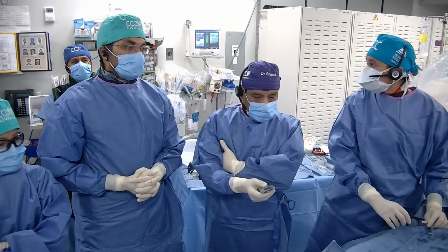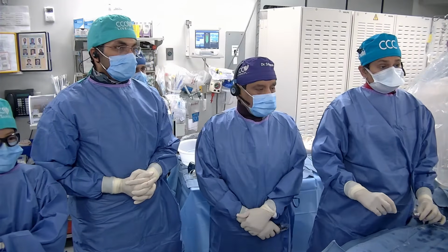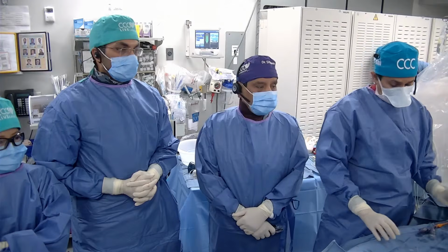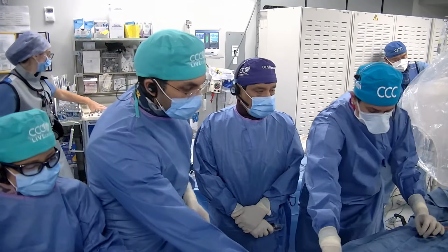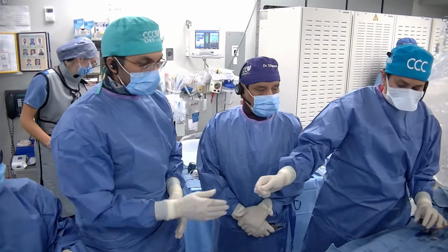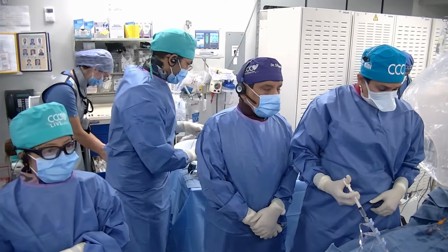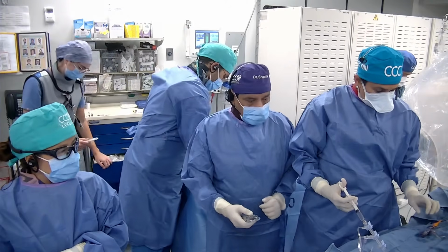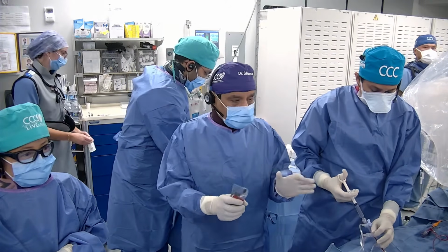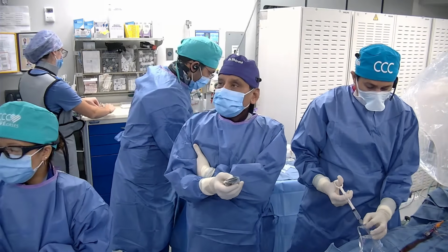This case which we showed has a long calcific LAD, and then a small to moderate size diagonal. Here is myself, Dr. Kini, and then we have two fellows, Sophia and Bharat, and of course the CVT team, Naira and Asif, and our nurses, Eldina and Will, and of course imaging is Kiski. Imaging will be needed. Question is at what level. We'll look into it, and let me present our case.